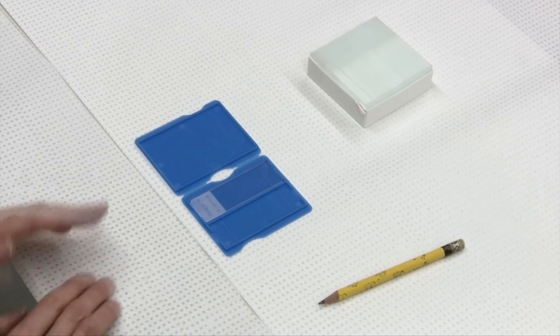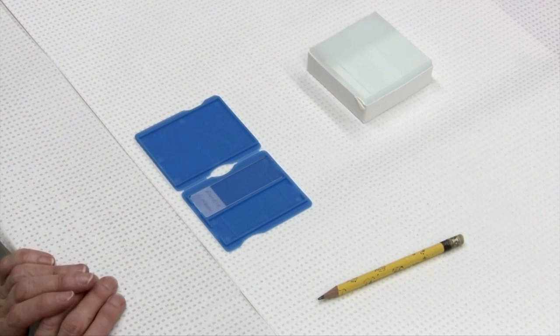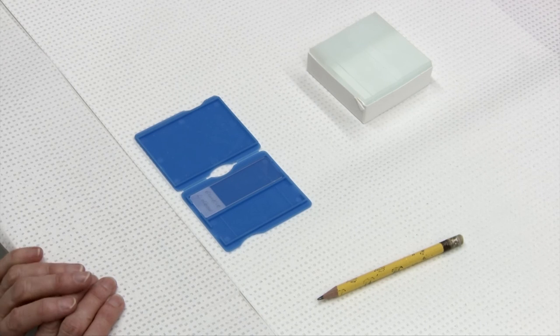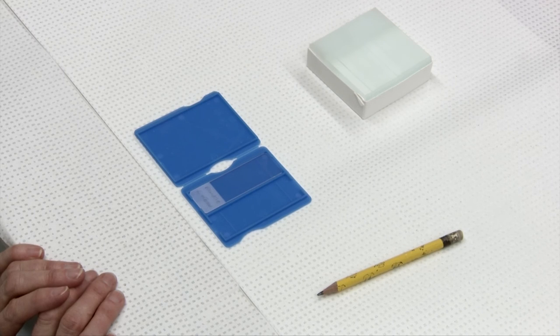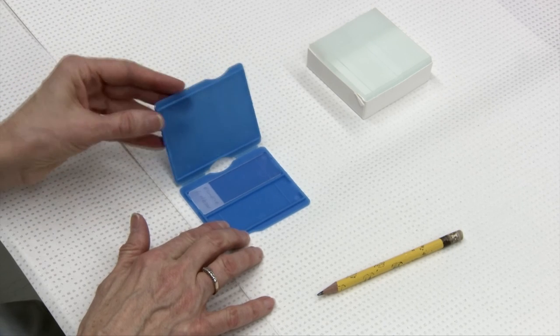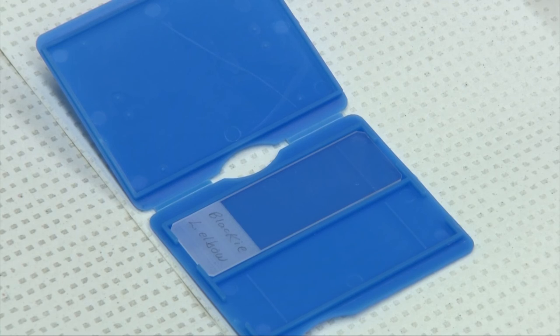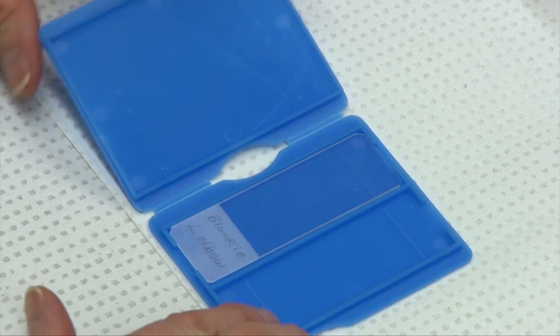These smears can be submitted to a diagnostic laboratory in the slide protector. You'll want to submit them not with any formalin-fixed specimens because that will cause cell disintegration and will ruin your sample. Once the smear is dried, you can close that top and it would be ready to package up for submission to your diagnostic laboratory.